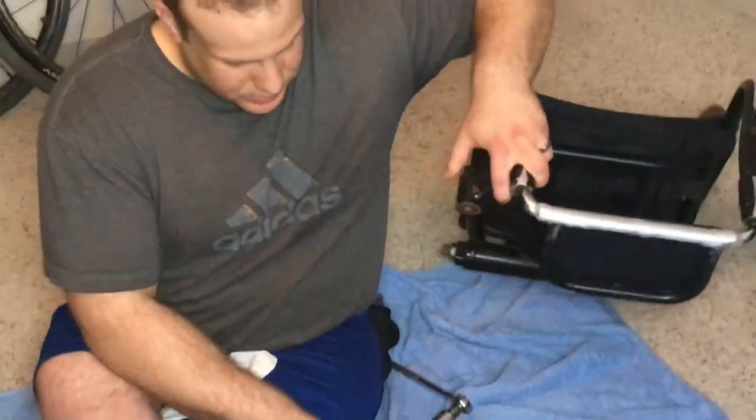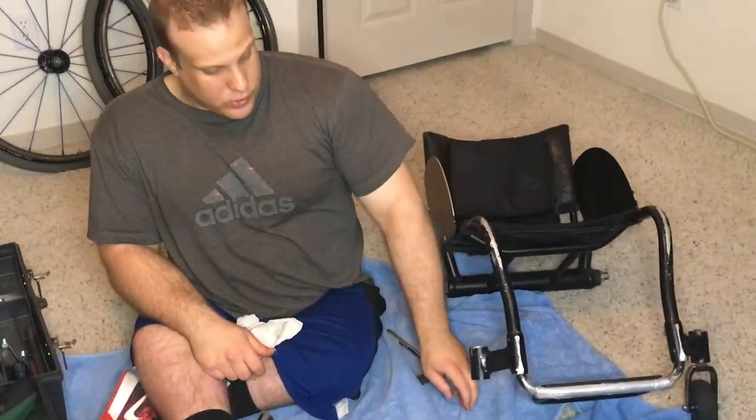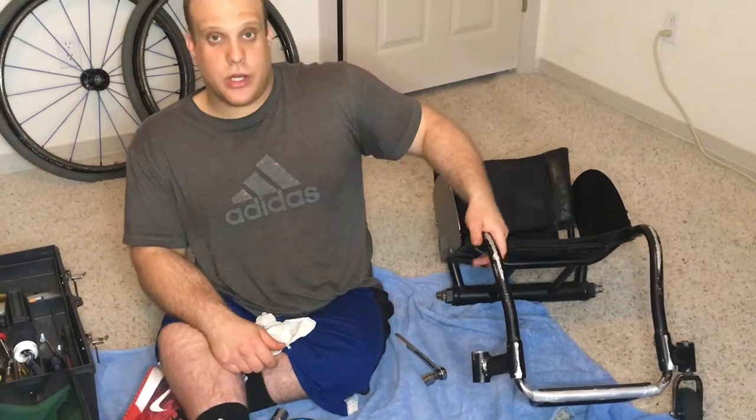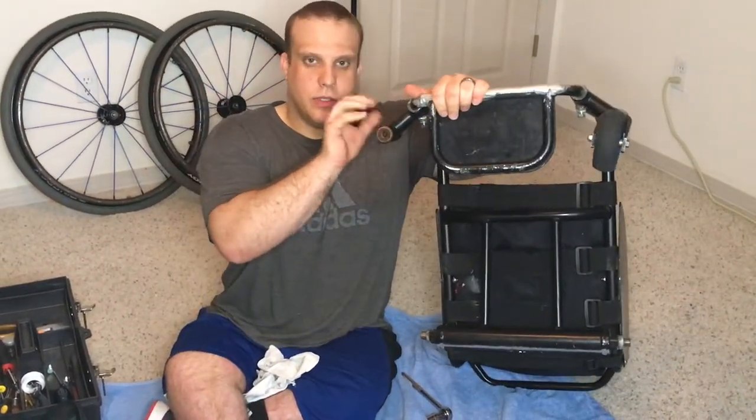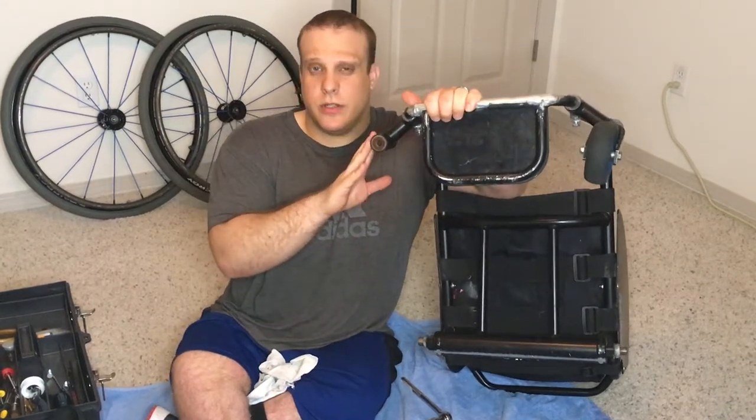The stem comes out the bottom like that. Now, like I said, it will differ depending on the type of chair you have. The nice thing is that a lot of the new designs are actually going to more of a sealed compartment, so you don't have to worry about this nearly as much.